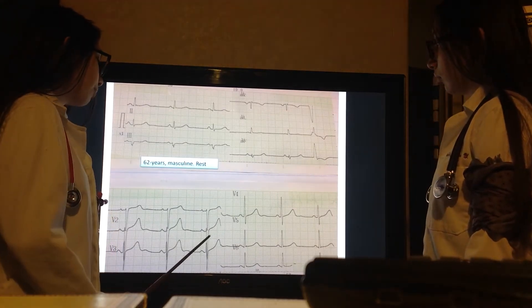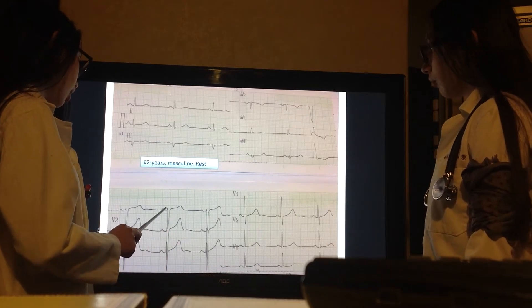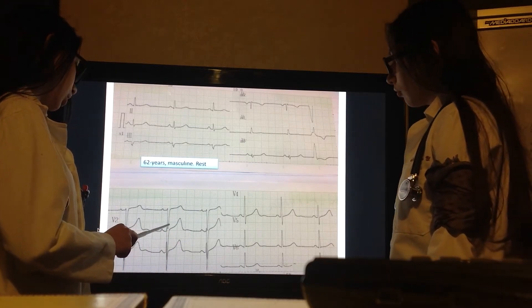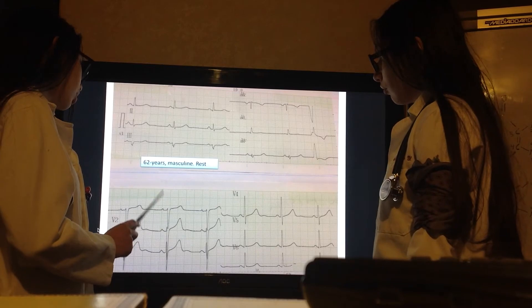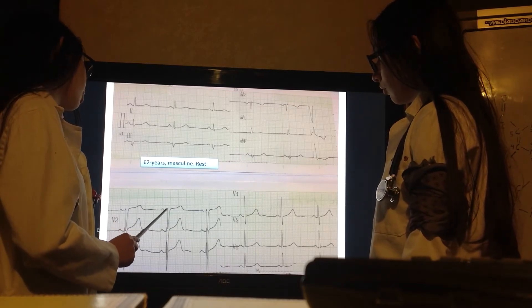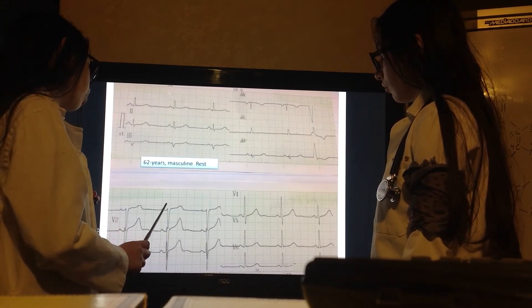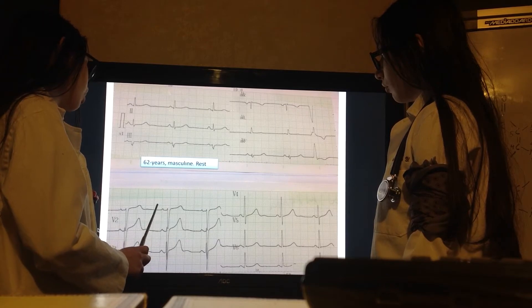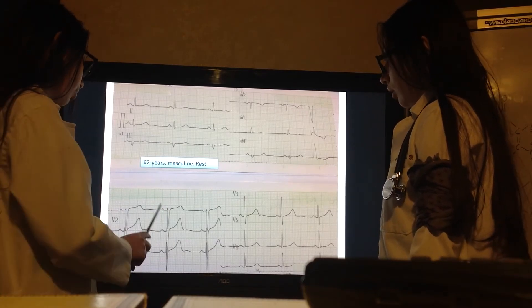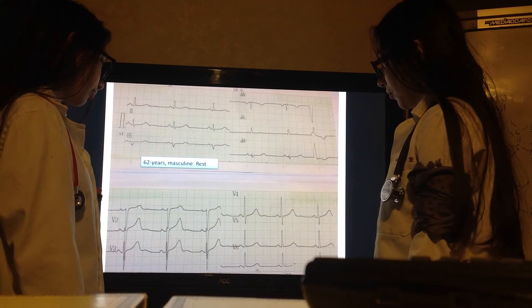For right ventricular hypertrophy, the R of V1 has to be greater than the S — and it is not — or the R in V1 has to be greater than 7 small squares, which is 0.7 millivolts. So there is no right ventricular hypertrophy.